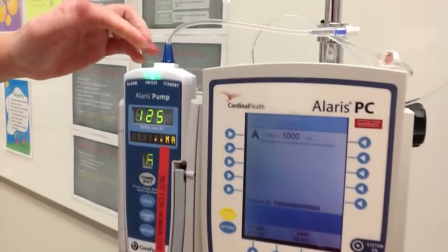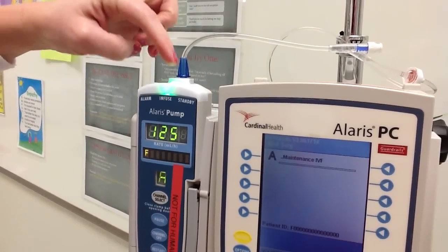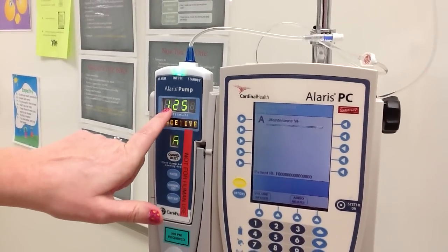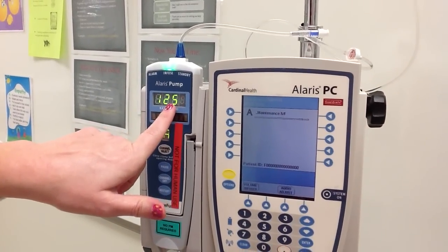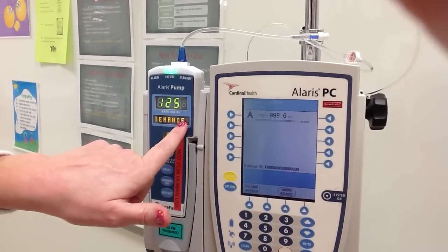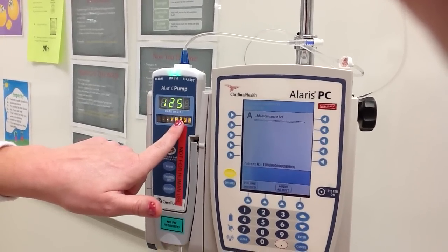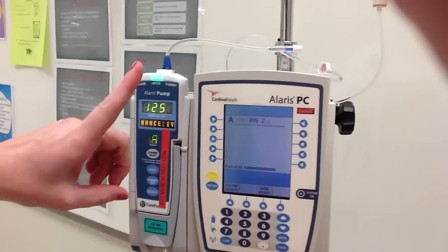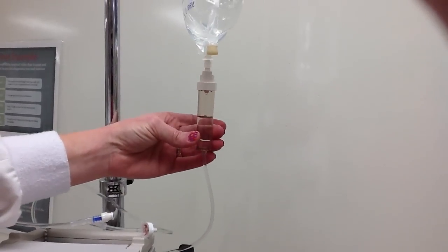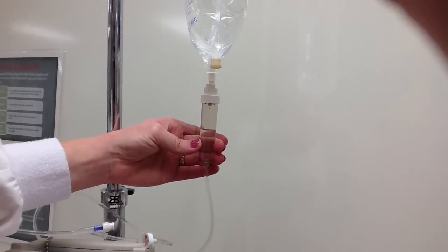I'm going to hit start. You know that you're good when you have green — green means go. That's telling me that my IV fluids are running correctly. It's also going to tell me the rate the physician has ordered and what I have running, which is a maintenance IV. I also like to check that I can visually see drops falling from my IV bag — you can see the drops coming out of the IV bag here.